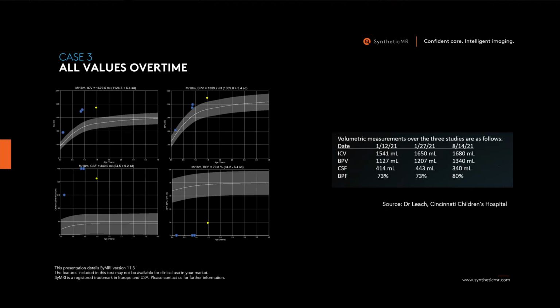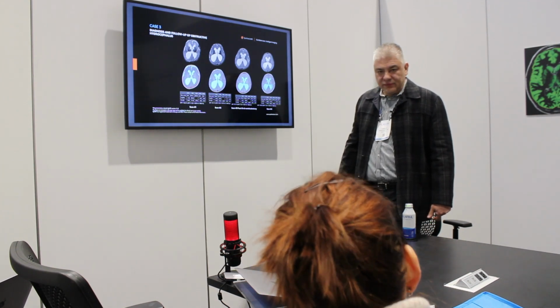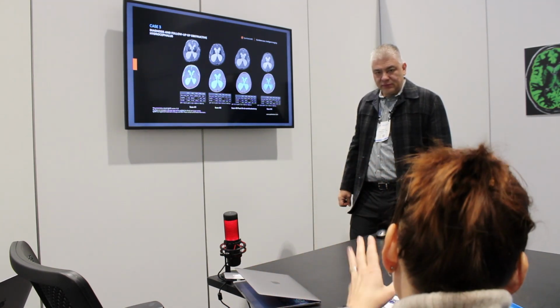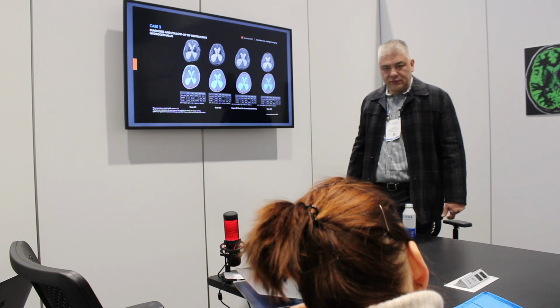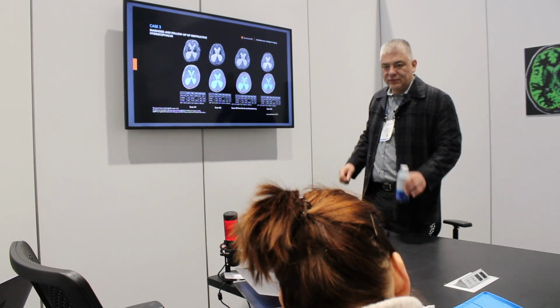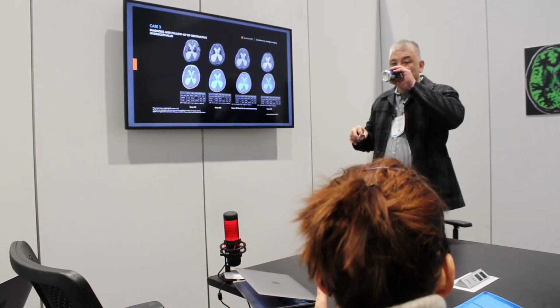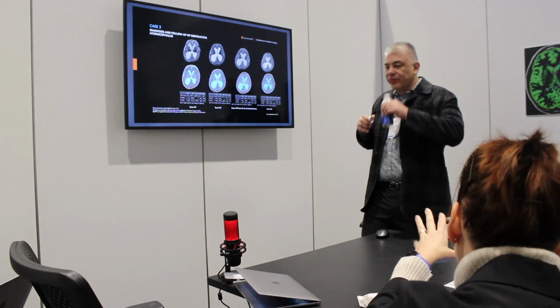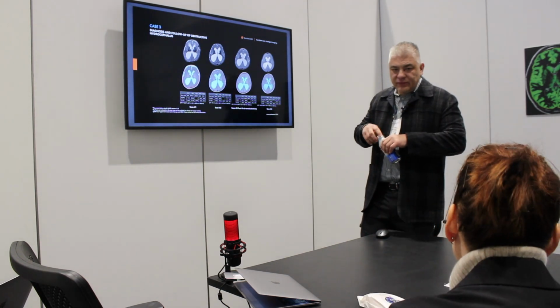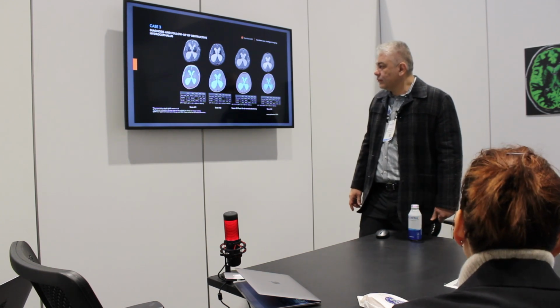And you can see the change of value in the curves. Next. Please, just go back. Wait one second. Just one more. I agree with you with the size of the ventricles. Yes, it's difficult to see that there is less CSF, but you can't see it in the outer spaces. Subarachnoid, it's visually seen.